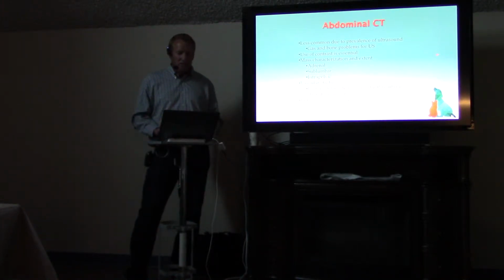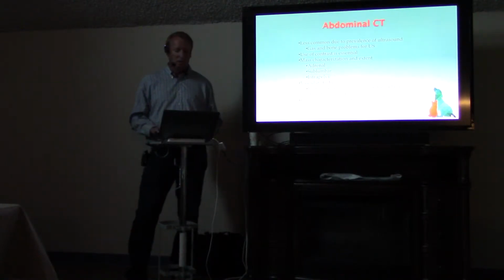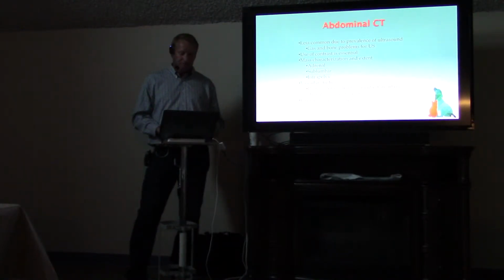And there's also certain vascular studies that we will do abdominal scans on, portosystemic shunts, vascular thromboses like portal vein thrombosis, and then intravenous pyelography exams like I showed you before.